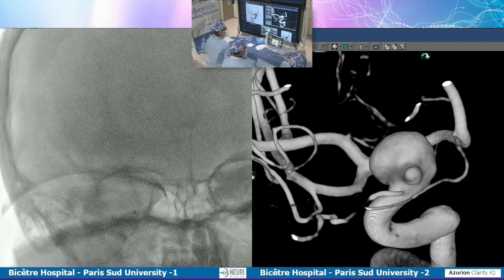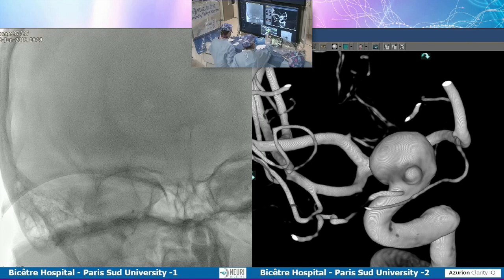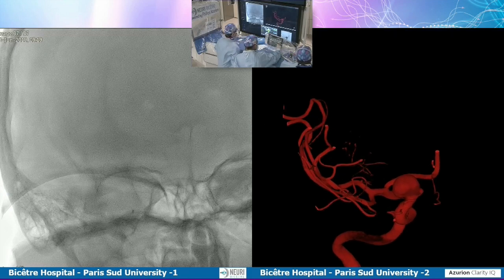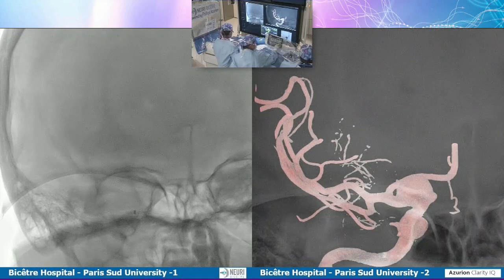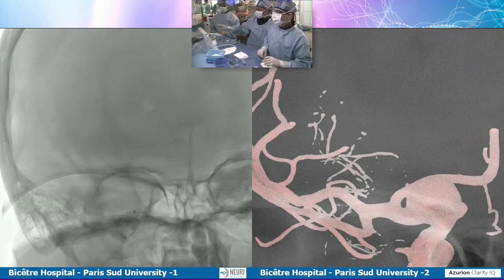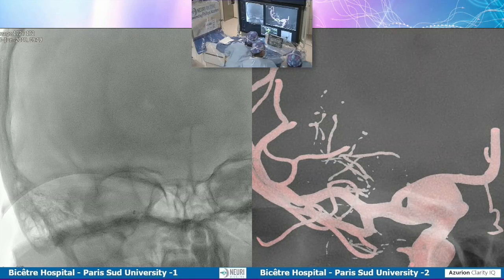Okay. So you understood how we manage with the LINNC. If you are lucky enough to have this program incorporated into your angio suite, it's really easy to use, very convenient, and gives a very informative result. We like to play, especially for the flow diverter and the aneurysm, with the 3D roadmap.